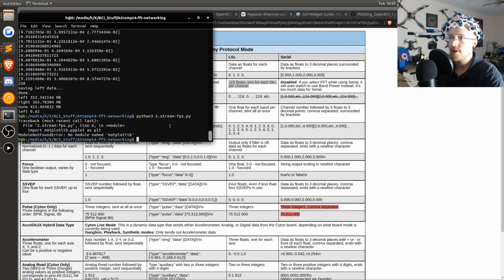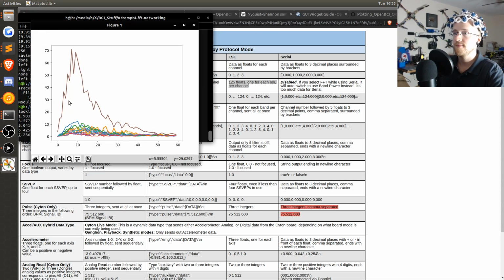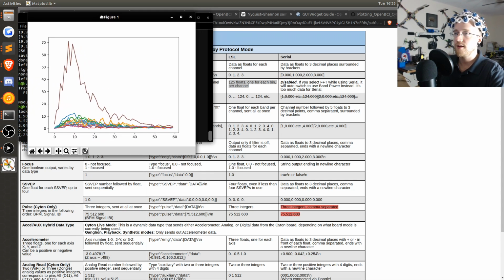So I'll just run that one. Let's see. Oops, not Python 3. Python 3.7. So this is at least closer to what we're expecting.